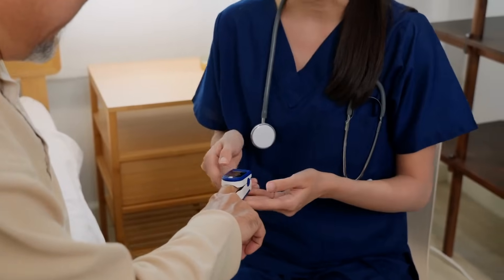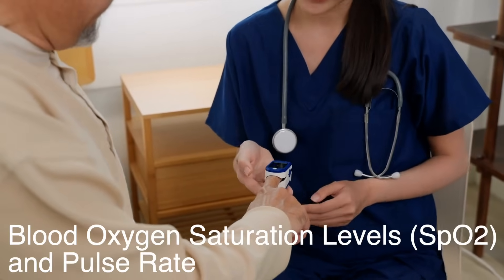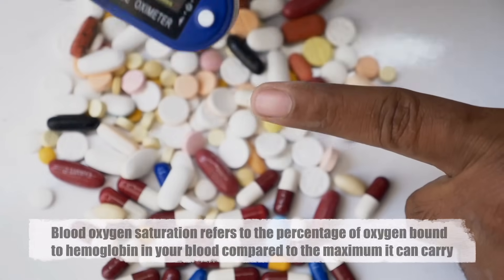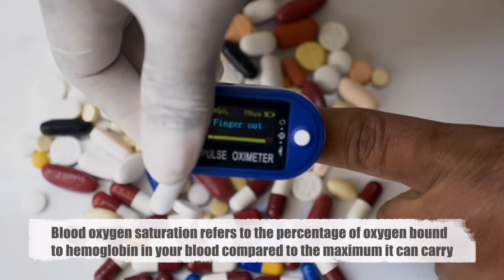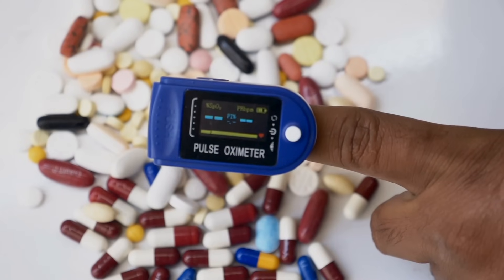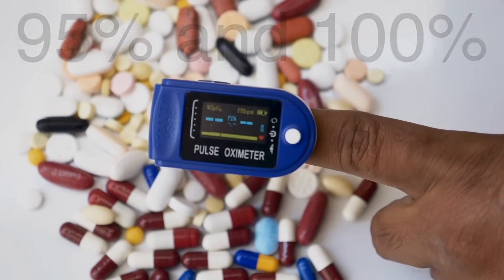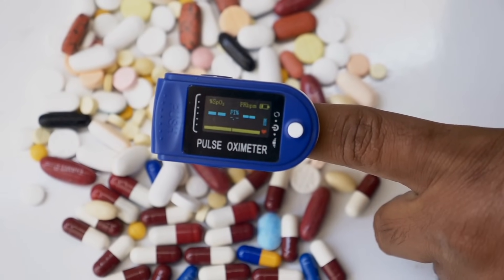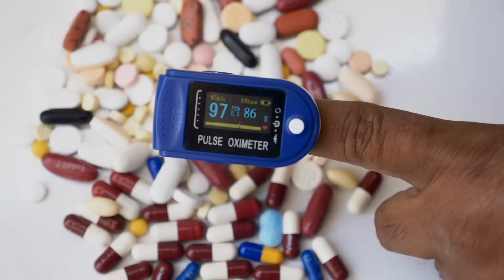A pulse oximeter is a small, non-invasive device designed to measure two key things: your blood oxygen saturation levels (SpO2) and your pulse rate. Blood oxygen saturation refers to the percentage of oxygen bound to hemoglobin in your blood compared to the maximum it can carry. A healthy person typically has SpO2 levels between 95% and 100%, while anything lower could indicate potential health issues. It's a quick, painless, and efficient tool that helps healthcare providers and individuals monitor respiratory and cardiovascular health.